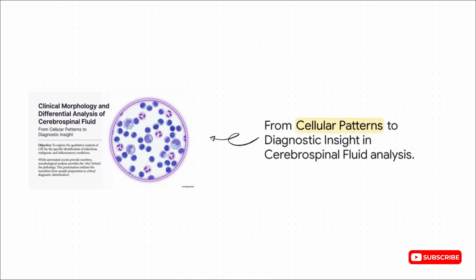All right, today we're diving deep into the clinical morphology and differential analysis of cerebrospinal fluid. We're going to go on a journey from just looking at basic cellular patterns all the way to gaining some really powerful diagnostic insight. Our whole goal here is to figure out how a qualitative look at CSF can help us pinpoint all sorts of things: infections, malignancies, inflammatory conditions.